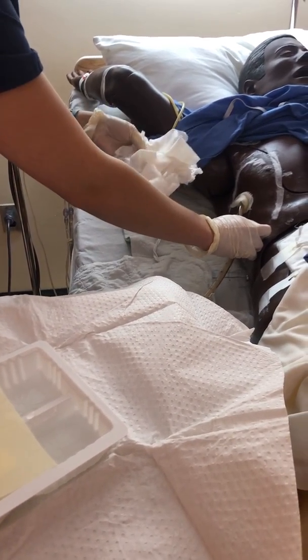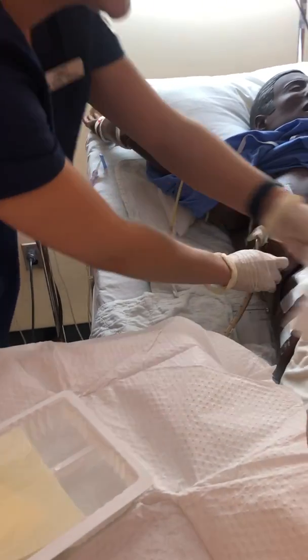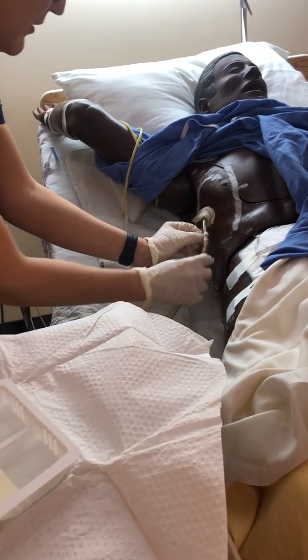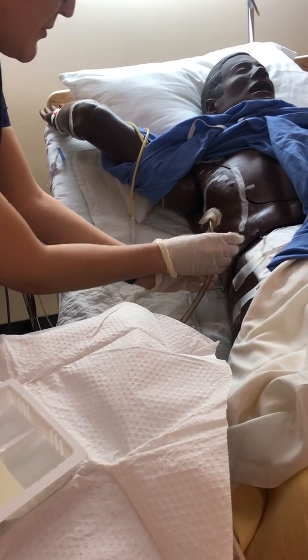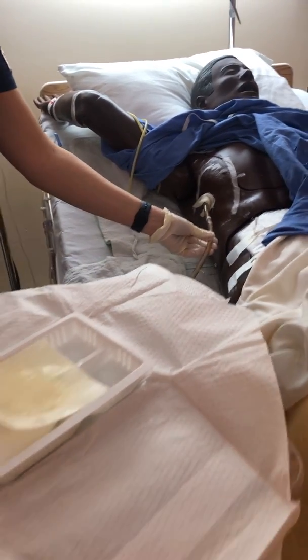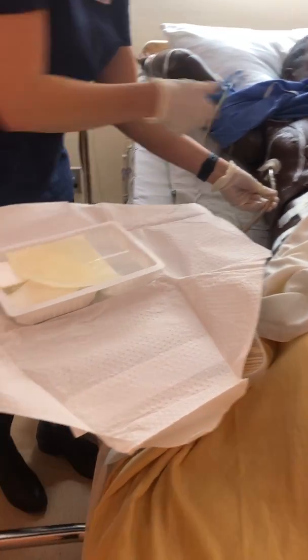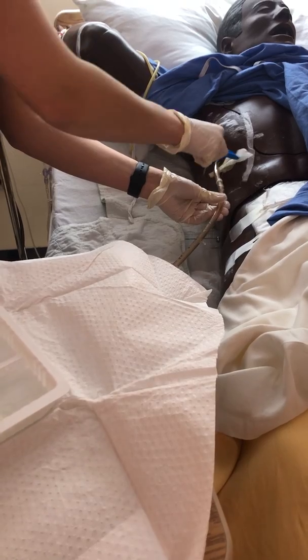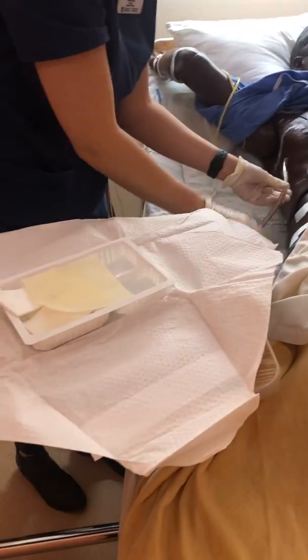So yeah, to assess the dressing here, there's minimal amount of drainage. Everything looks good. I'll write that in my documentation after. And I would make sure that all this stuff is off of the tube. But since this is a demo, it's been used. It's very stuck on there. So I would take my forceps here to remove this old Gelonet while still stabilizing the tube. And I would discard both of those.